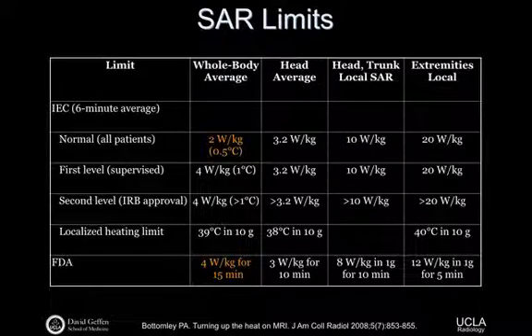In terms of guidelines, there are different guidelines depending on where you live. IEC governs continental Europe, maybe the UK as well. And then, of course, what we mostly care about is the FDA. Lots of limits, lots of small details here. Probably the limit we most regard and most encounter is the so-called 4 watts per kilogram over 15 minutes.